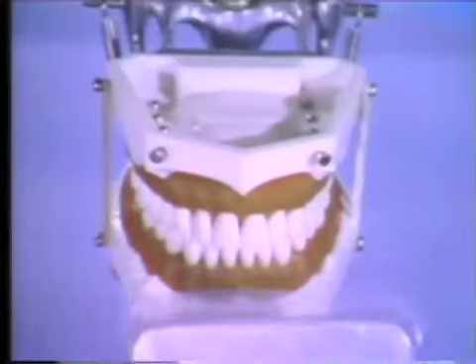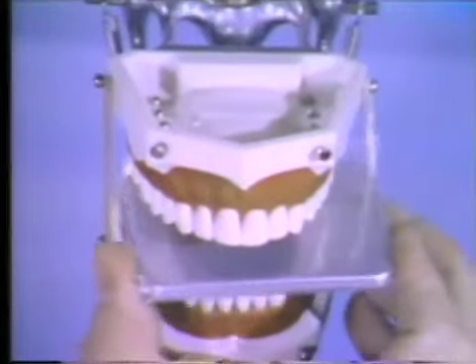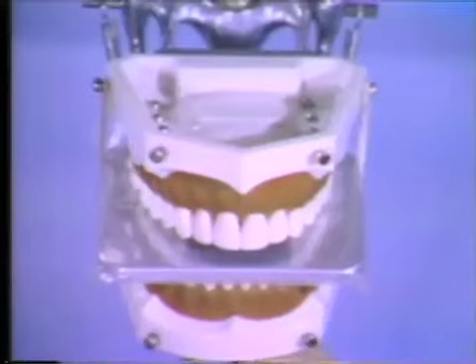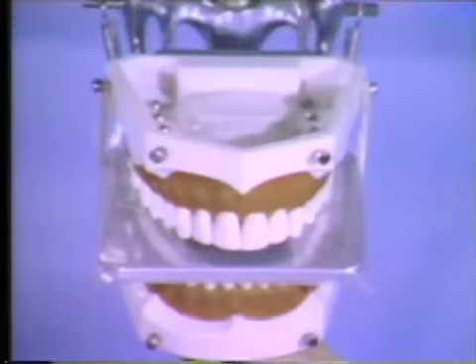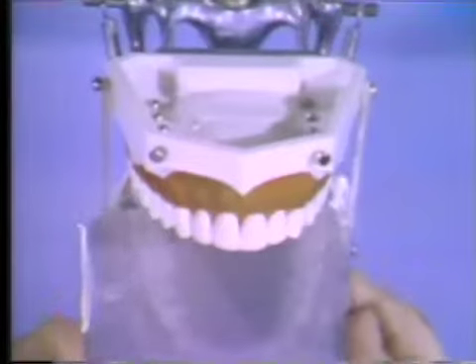In positioning the film, the long aspect is placed from side to side. The placement is symmetrical bilaterally. The surface of the cassette bearing the letter R is against the upper teeth, and about 1/4 inch of the front edge of the film is anterior to the incisal edge of the teeth. The vertical angulation should be set at 75 degrees and forward toward the seated patient's feet.